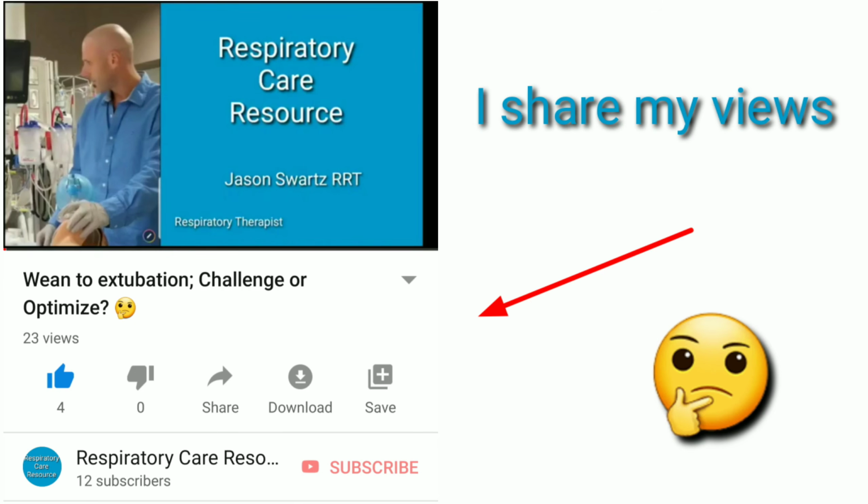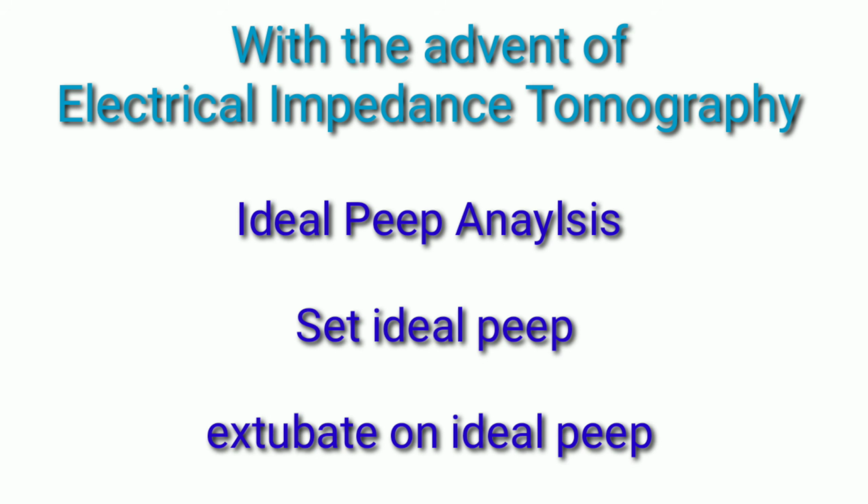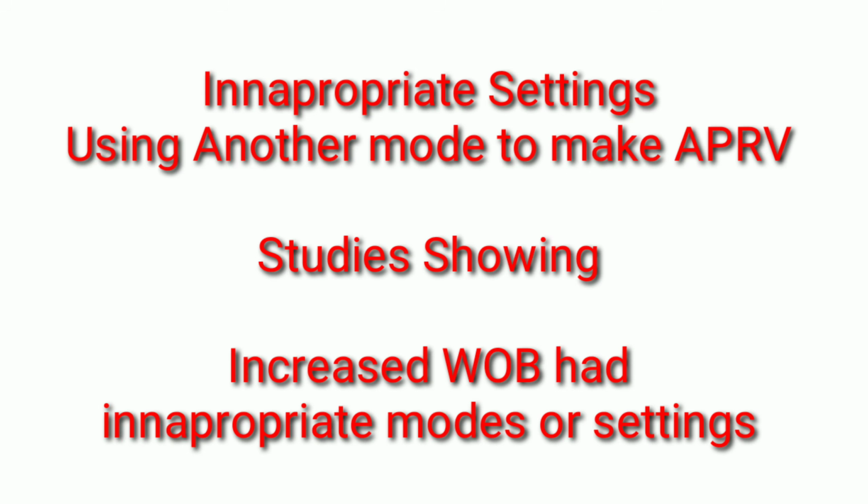Seems to me that if you like to do that, that's fine, but take the time to not extubate right away, to re-recruit the lung prior to extubation. It's just, to me, seems counterproductive to do that and then to extubate.